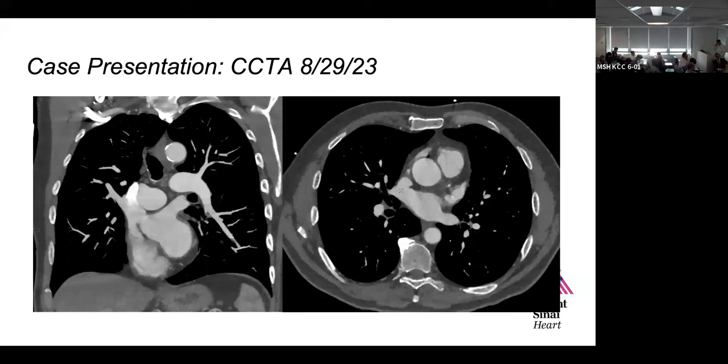It depends. If it's a pre-interventional procedure, we might do that. Usually we would do venous phases in a single ventricle palliation, not necessarily in this particular case. I would say, sometimes if it's requested or the catheterizers or the surgeon is really interested in that information, we'll do it.